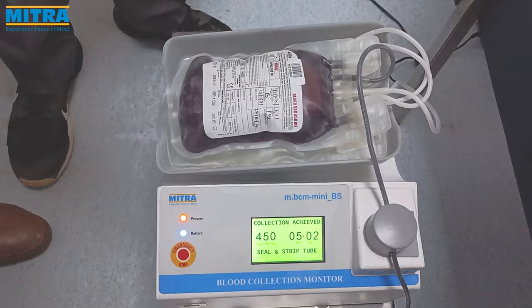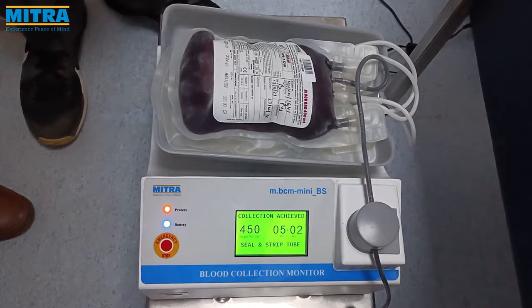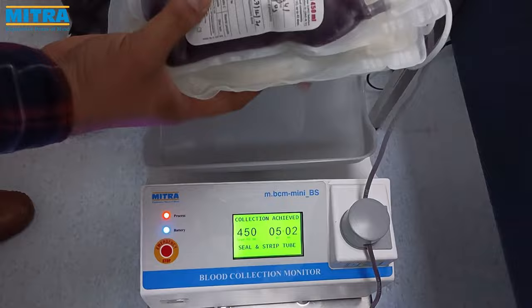Once the targeted volume is achieved, the machine will automatically clamp the tube and blood collection stops. The display screen will show the given target volume, achieved volume, and the time taken. The clamp is automatically released when the bag is lifted at the end of the collection procedure.